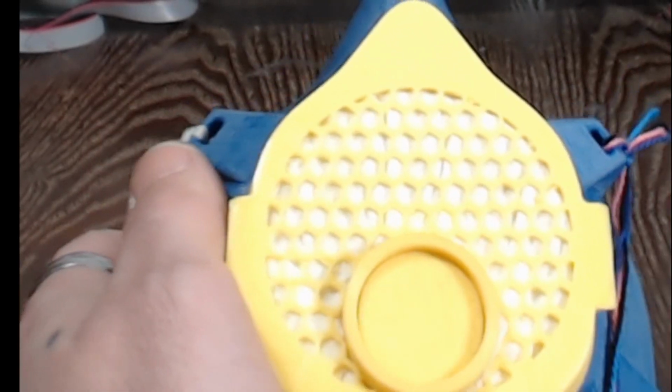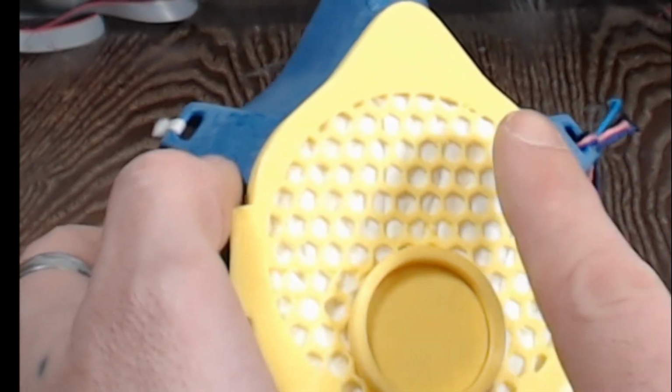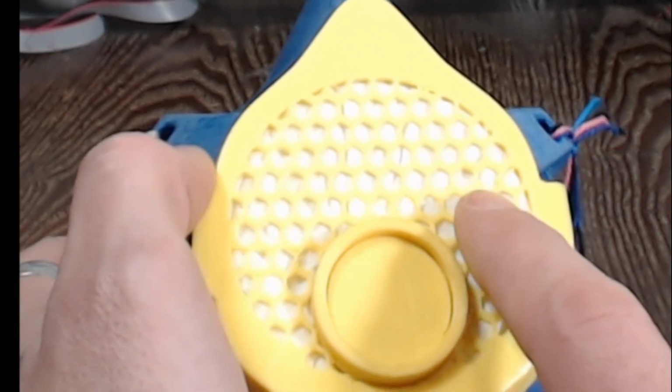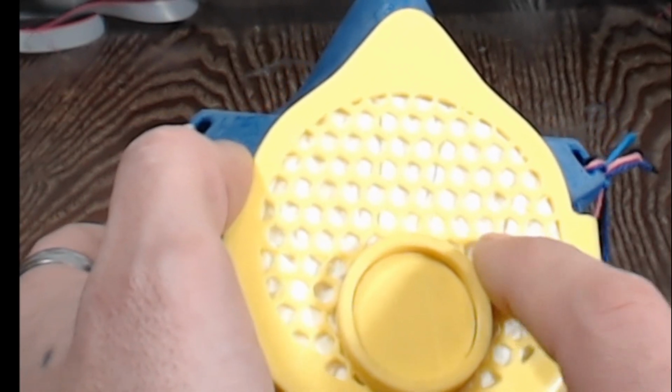And the filter is basically just a filter that's been cut to fit. The piece that I used to cut this filter out of, I can get probably three or four more filters out of, and it was pretty cheap for a medical grade filter. Now, this is the utilitarian part of your mask. This is the most important part. You're gonna want some sort of filter that is approved for medical use.